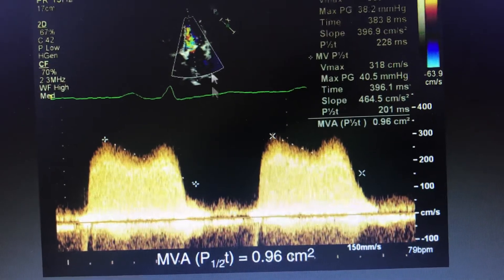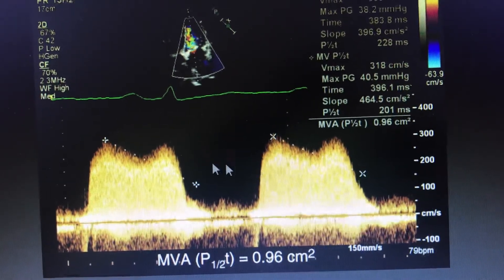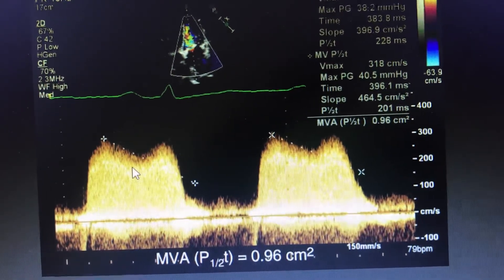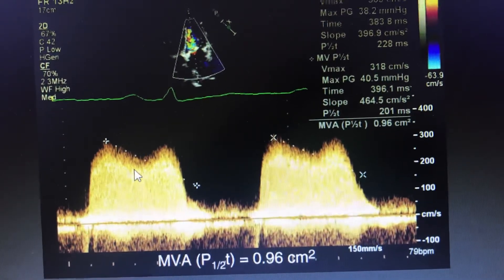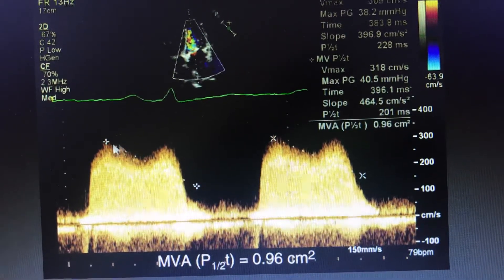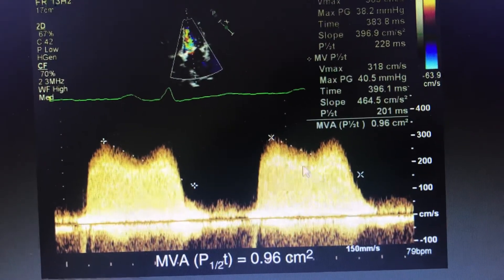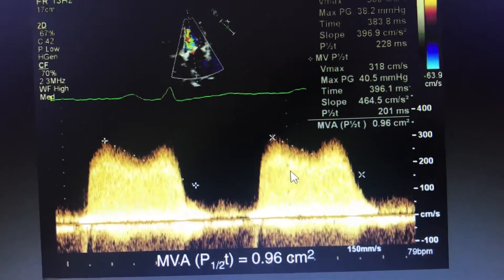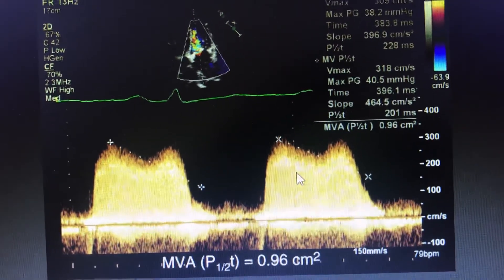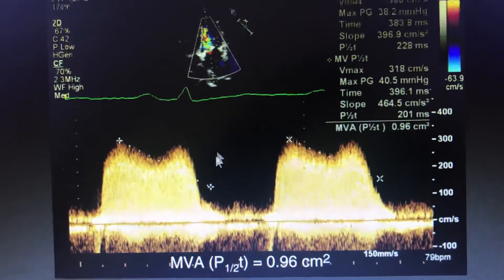If there is no mitral stenosis, that would signify most probably diastolic dysfunction, but here there is a huge mitral stenosis. So this much EF slope will never be seen in actual diastolic dysfunction.